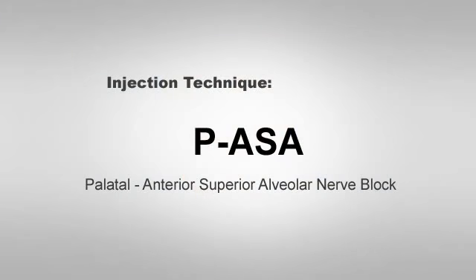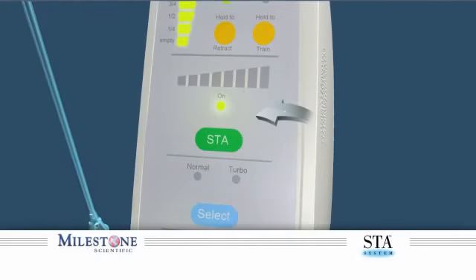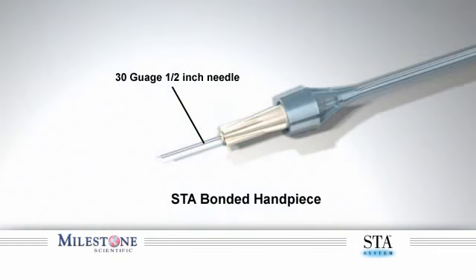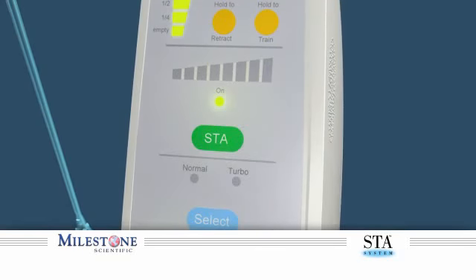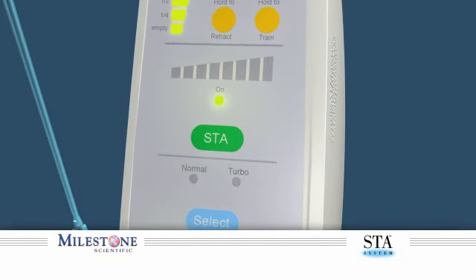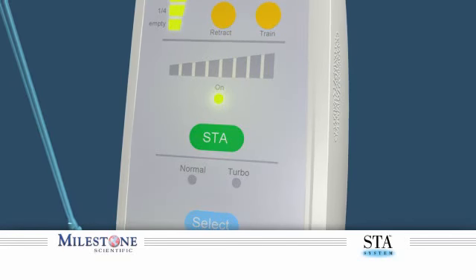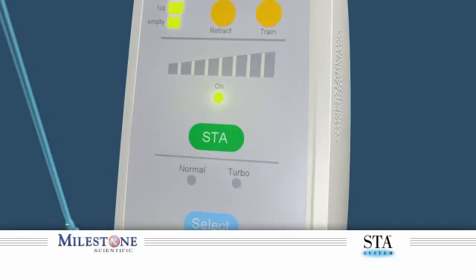Injection technique: P-ASA, or palatal approach, anterior superior alveolar nerve block. Before you begin, verify the STA system is set to the STA mode. It is recommended that you use the 30-gauge half-inch bonded STA1 handpiece for this injection. Please note it is critical to use the STA mode for this injection to ensure that a safe and controlled single flow rate is maintained throughout this injection.